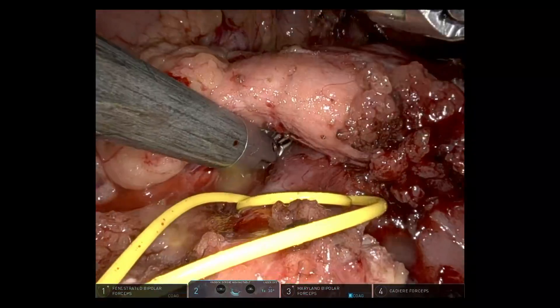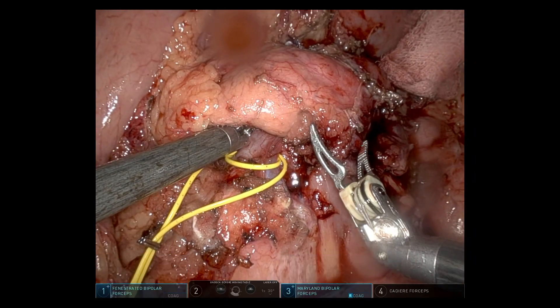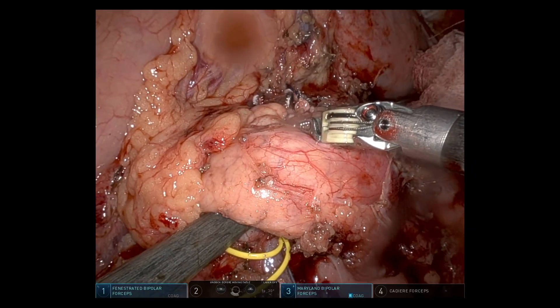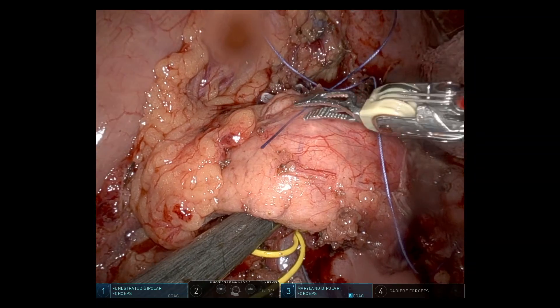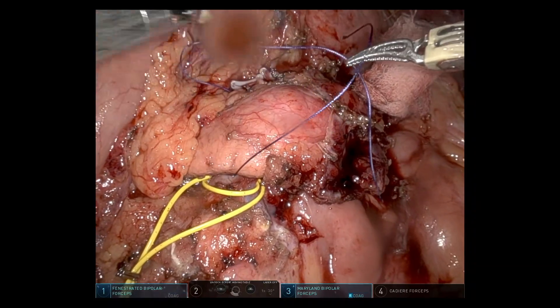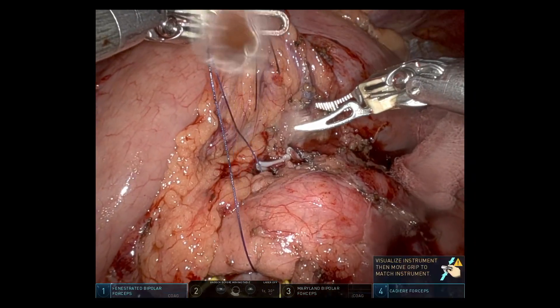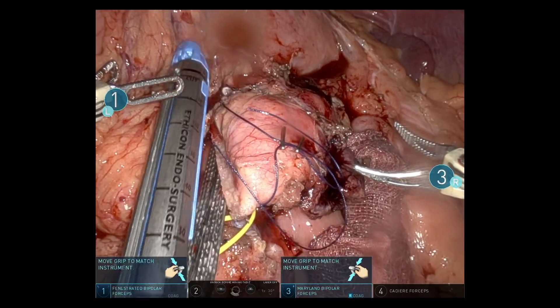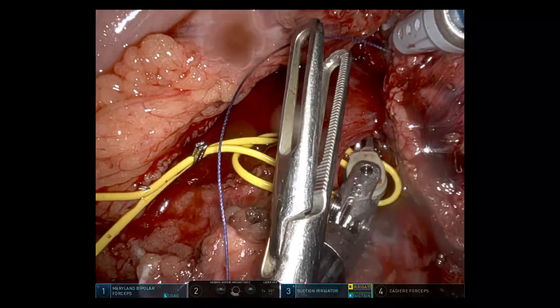Before going further with the splenic vein, I'm dividing the pancreas. I place a tie around it to pull the main body into the stapler, using the same stapler as laparoscopically — an Echelon Flex with an appropriate reload depending on pancreatic thickness. In this case we used a blue reload. We do progressive compression over 5 minutes, then clamp the stapler closed for a minute prior to firing. Haemostasis was good and I didn't need to overrun the staple line.